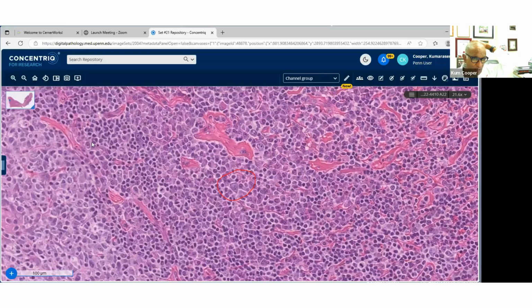There's an extranodal MALT lymphoma as a possibility. And what else do we have? I'm just looking to see. Okay. And then, of course, Castleman's. I did raise that possibility as a possible background of Castleman's, but I'm not sure about that. Follicular dendritic cell sarcoma, yes, it is, but this is a variant of that. And this is the so-called inflammatory variant of follicular dendritic cell sarcomas.